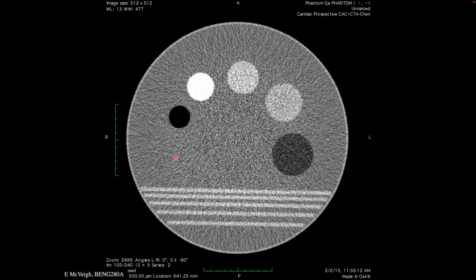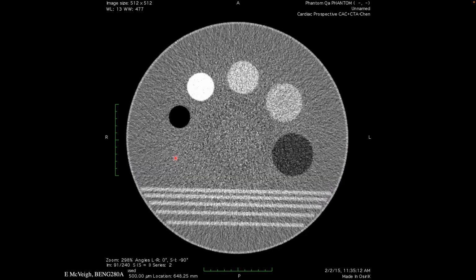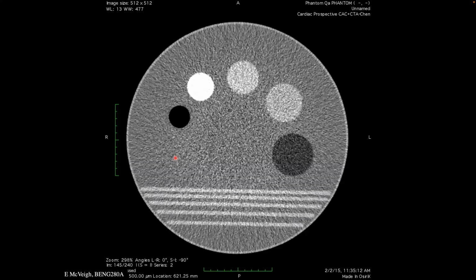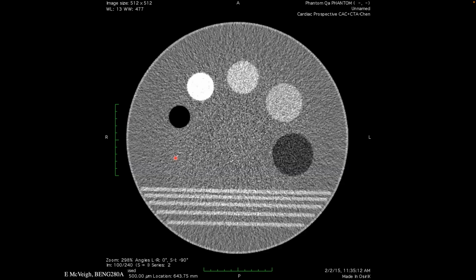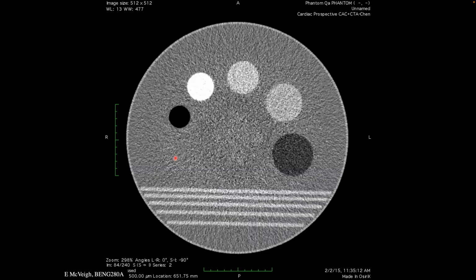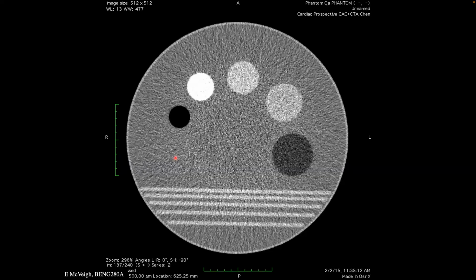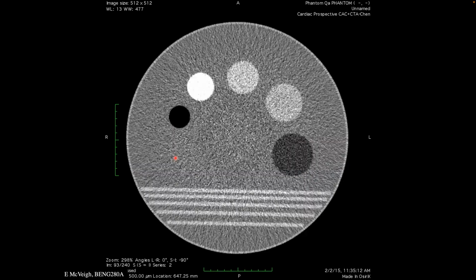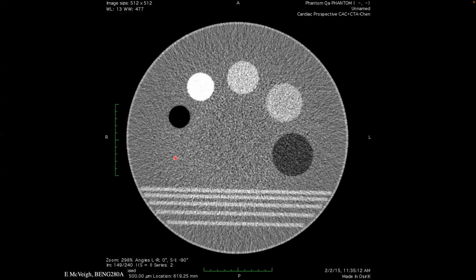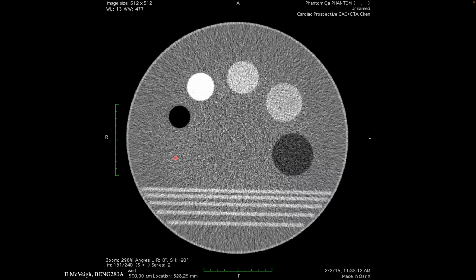MR has a simpler model for noise, in that the noise source basically comes from infinite bandwidth white noise that is thermal. And so that just gets plopped onto the scan. It does get modified to some extent if you start doing sophisticated acceleration techniques with MR and solving for different parts of the field of view given different coils and things like that. The noise can get more complicated, but at its heart, it's essentially a completely random set of numbers.